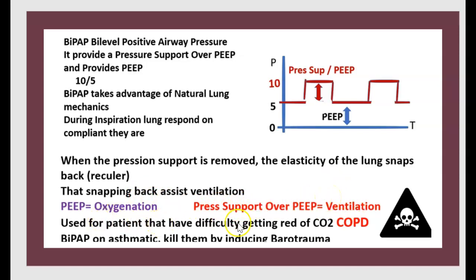Use it for patients that have difficulty getting rid of CO2, COPD. BiPAP in an asthmatic is very dangerous. It could kill them.